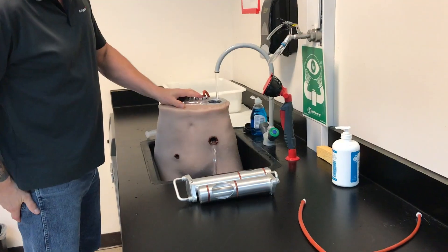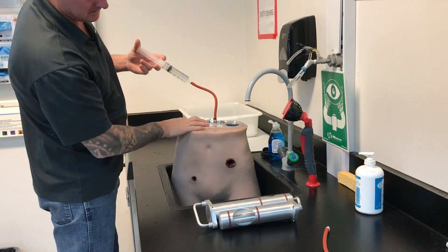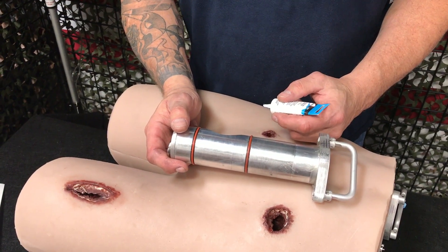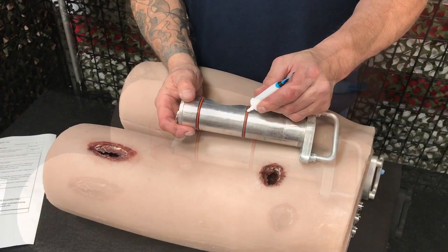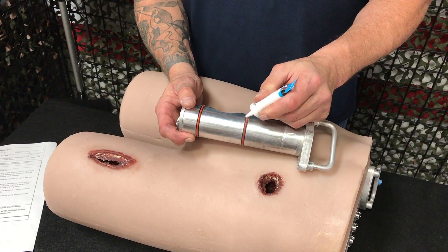When you're finished training, rinse the mannequin and cylinders with water. Ensure you flush the arteries using a 60cc syringe filled with water. The cylinders have orange and black o-rings to help seal in the fluids. Before every use, ensure that the cylinder and o-rings are coated with a silicone lubricant.